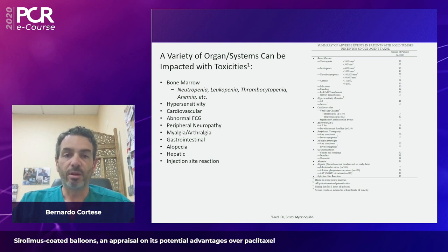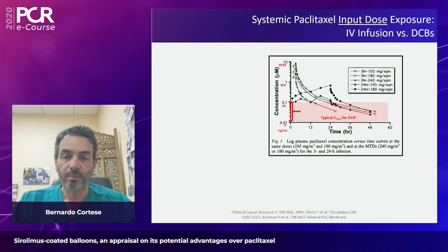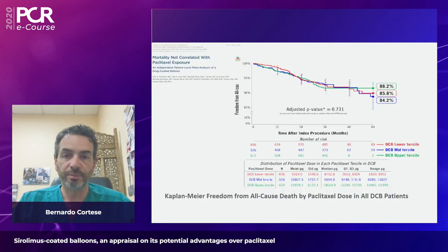However, all of us know the toxicity of Paclitaxel when administered via the systemic way. We know that it is mostly associated with thrombocytopenia and leukopenia, and the risk of adverse events may be very high at high dosages of this drug. We also have to admit that the release of this drug after drug-coated balloon use is quite different compared to the release of the same drug for cancer patients during chemotherapy. So it is very different from the total dosage of drug that we administer in our patients.